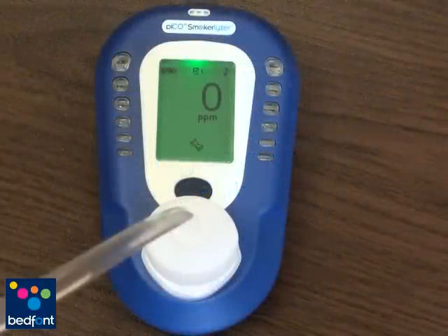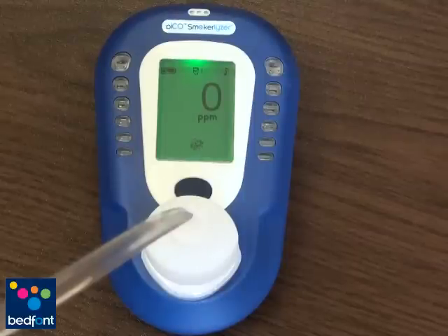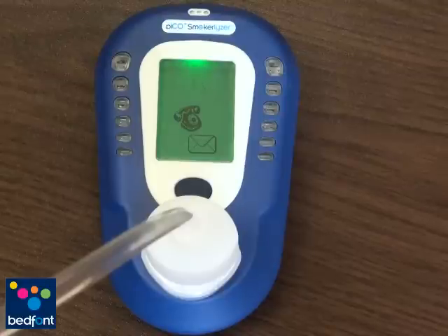If the calibration fails, a cross will appear. Please check the gas has not run out or is switched off. Double click the button to try again. The PicoPlus will allow you to try three times. If all fail, the following icon will appear. Please contact Bedfont or your local distributor if you see this icon.